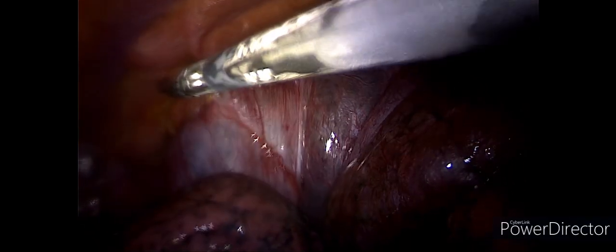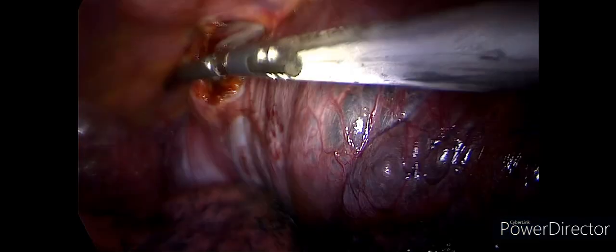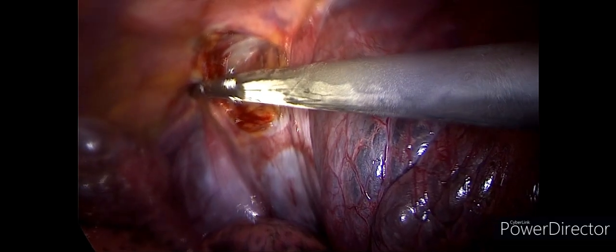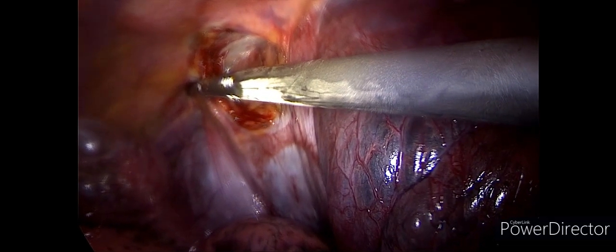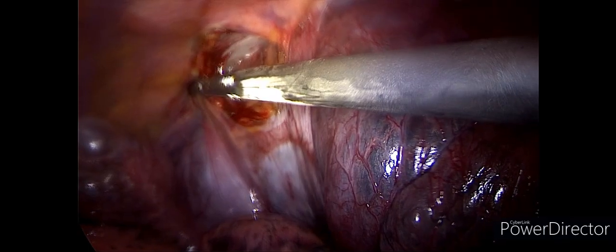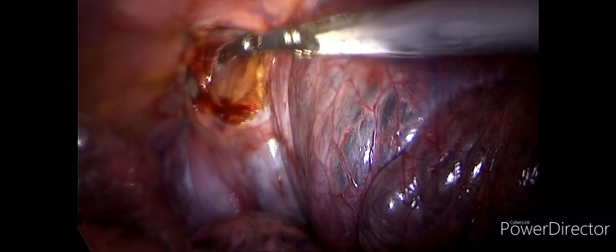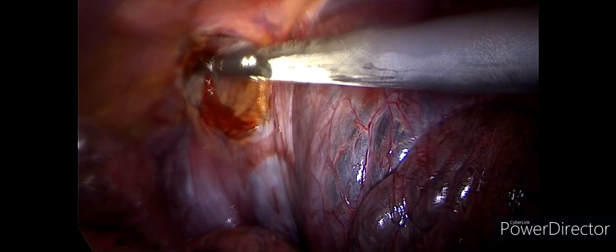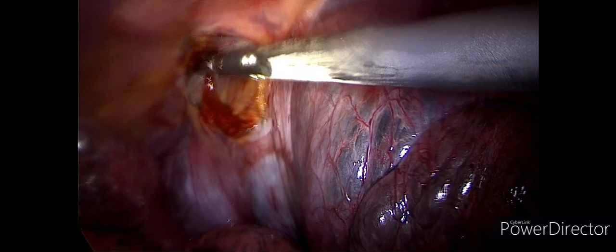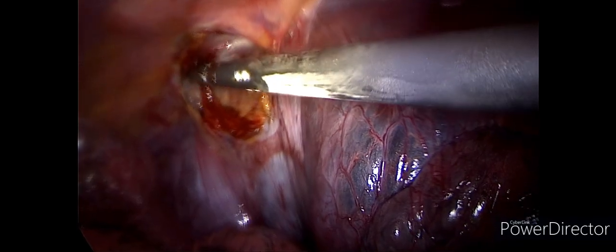at the end. Of course, most of the time you'll find adhesions on the chest wall, which we witnessed on the posterior and anterior chest wall as well as apical. These adhesions were taken down. It took a few minutes just to mobilize the large apical bulla. We also witnessed multiple blebs on the superior segment of the right lower lobe.